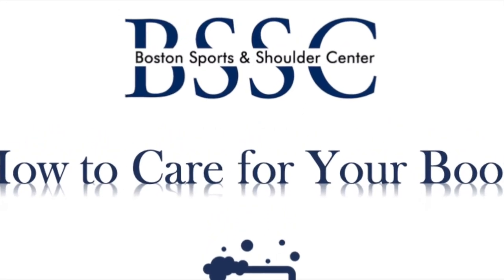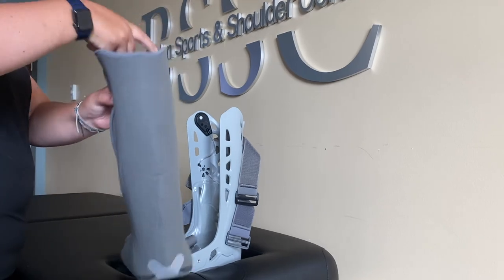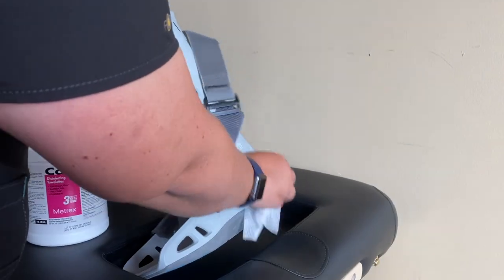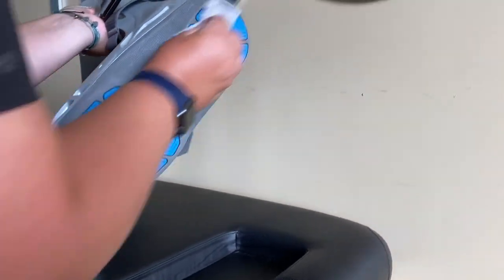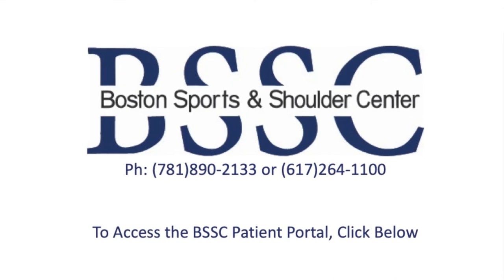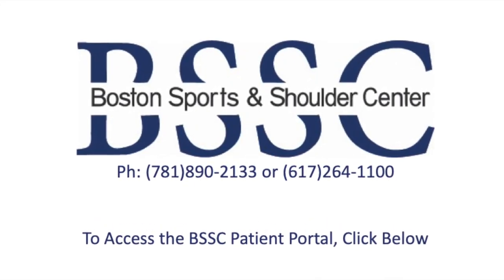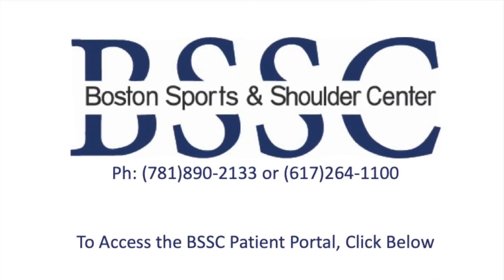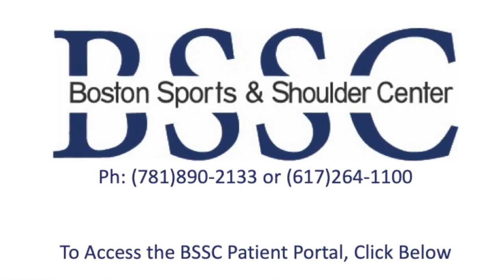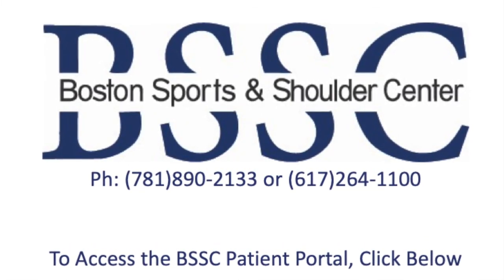The foam liner inside of your boot may be removed for cleaning. It is best to hand wash and lay flat to dry. The straps, protective front panel, and the outside portion of the boot may be wiped with a damp cloth. If you have additional questions regarding your AirCast AirSelect walking boot, please refer to your post-operative protocol, discuss with your physical therapist, or contact our office by phone or message through the BSSC portal to speak to a certified athletic trainer.